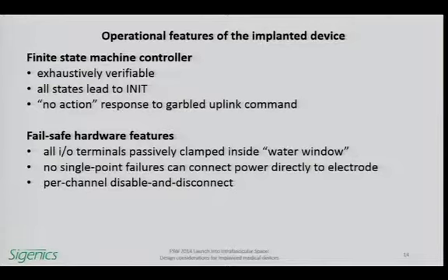Yes, indeed. Standing in front of you at this instant, I can't quote you the numbers, but yes, there are standards documents that apply to several different layers. The design process has to comply with a quality standard that involves proper specification of the requirements and engineering design and the whole design control flow and so on. It all ends up looking very familiar. The devices themselves have to comply to a bunch of safety standards, IEC 60601, Part 3. That's my world. Yes, there's a very rigorous set of standards, and they really come down to compiled common sense when you look at it very carefully.